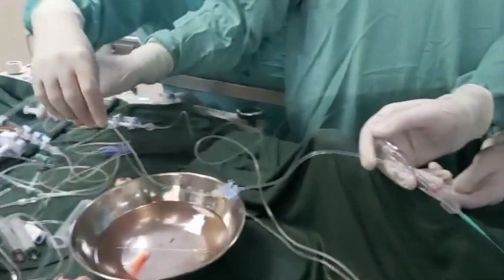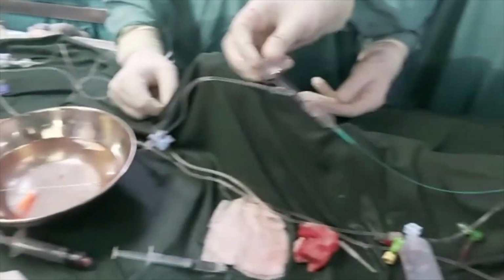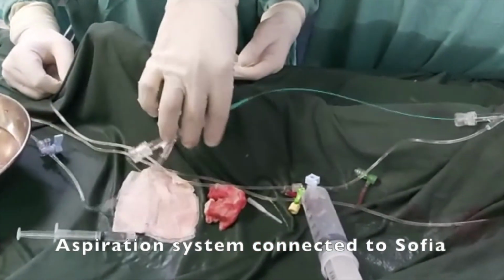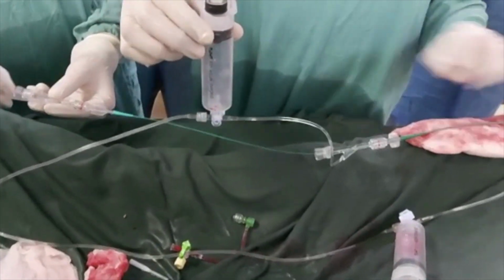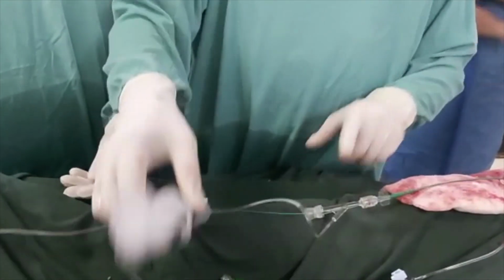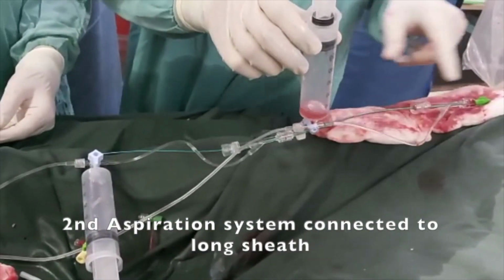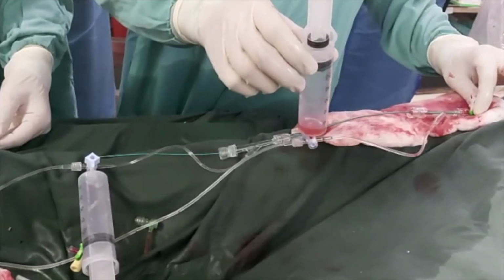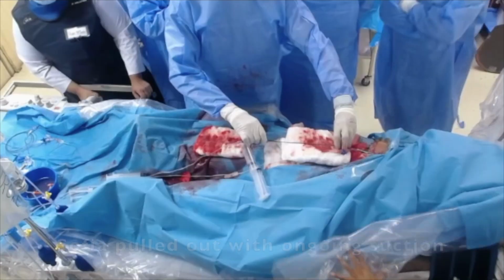Through this I can take a stent retriever in if I want to, but in this case I'm just going to do ADAPT, which is aspiration only first. So these are the two aspiration systems that are connected. One is connected to the Sophia Plus, the other one is connected to destination sheath. So this is the setup that you use in this procedure.